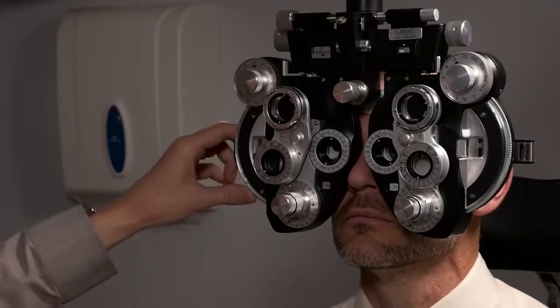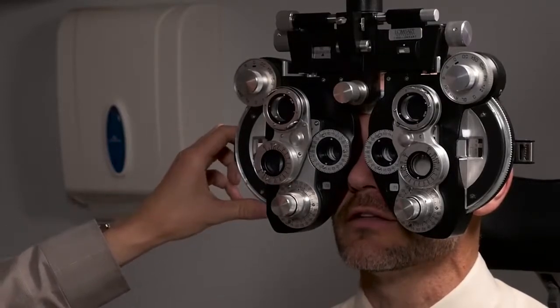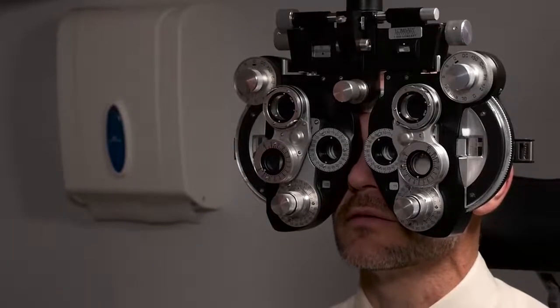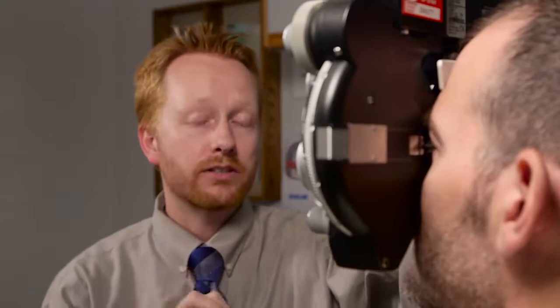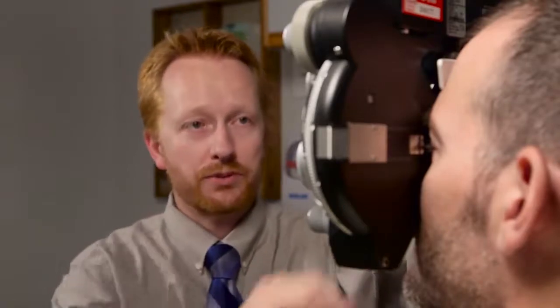I ask him, 'Is this any better?' — Yes. 'And even better?' — Yes. Once you get a good ballpark of the spherical component, you switch over to do the cylinder portion of his prescription. To do so, I turn this lens called the JCC. The JCC is short for Jackson Cross Cylinder, and it helps us refine how much astigmatism he has and what the orientation of that astigmatism is.